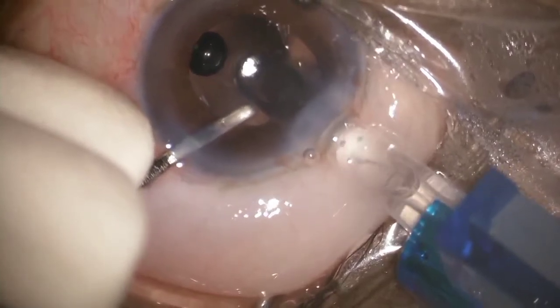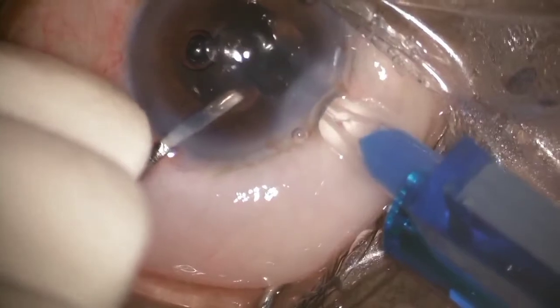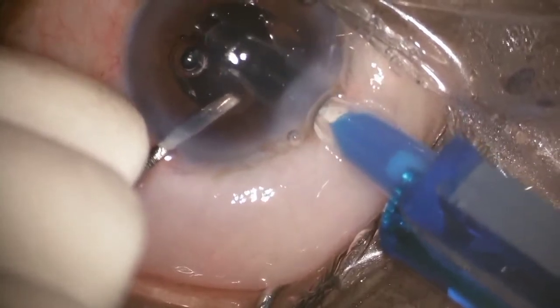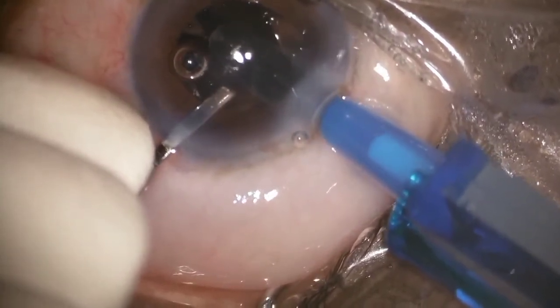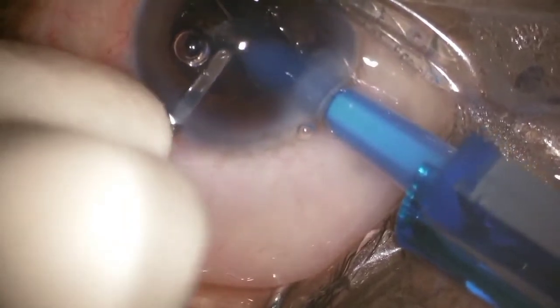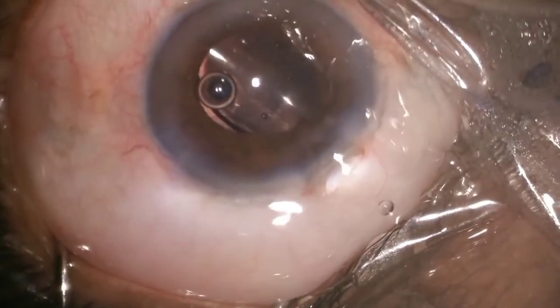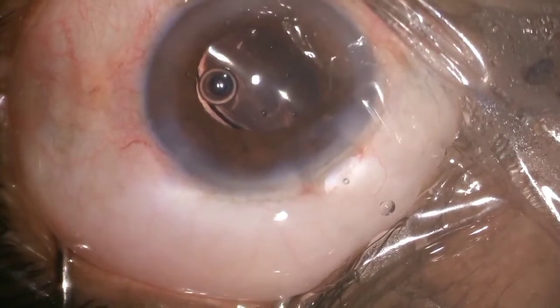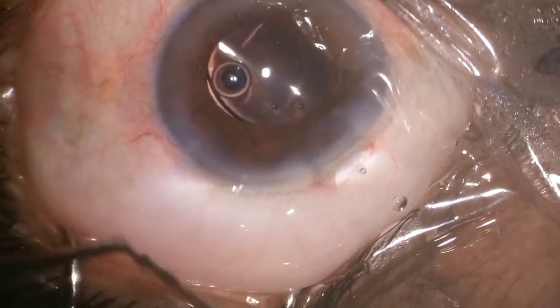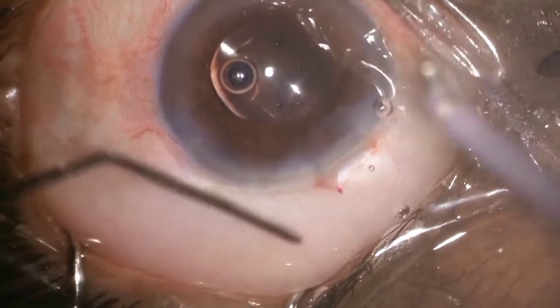So I was injecting the lens by the screwdriver technique, and I was doing it very slowly, so as not to do further damage to the capsule or bag. And the lens, thankfully, was in the bag, and then I did the final viscoat removal.